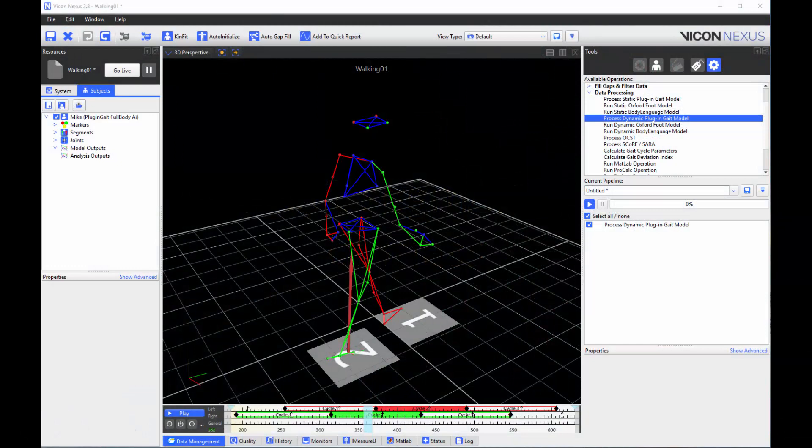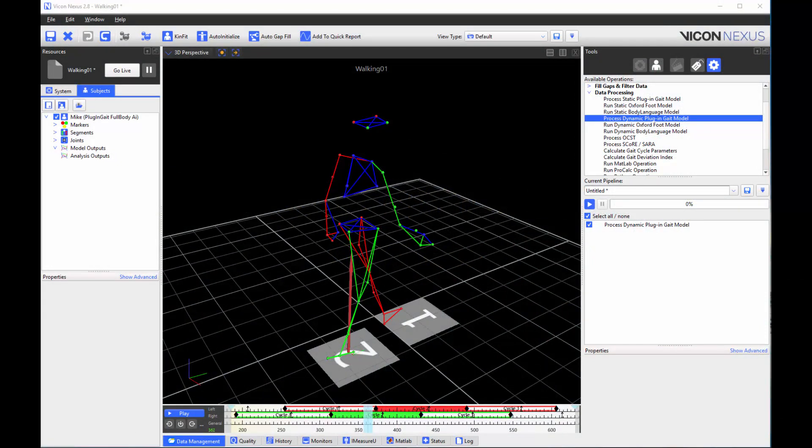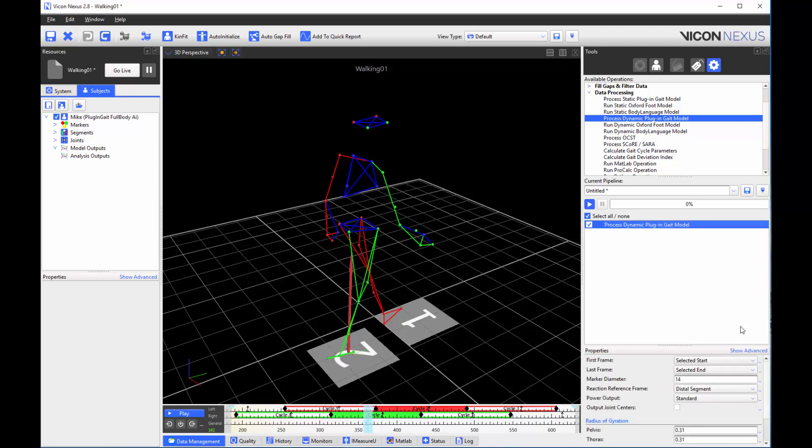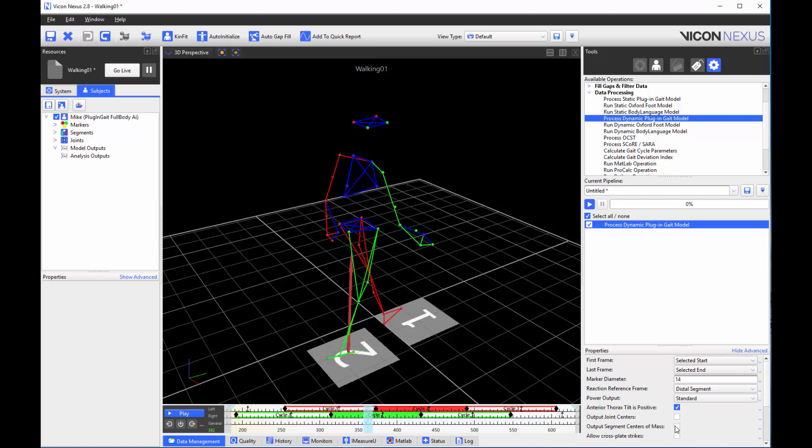Segment centers of mass calculated by the plug-in gate model can now be visualized and exported within Nexus. To output the center of mass, go to the properties of the process dynamic plug-in gate model operation, show advanced, and then check output segment centers of mass.